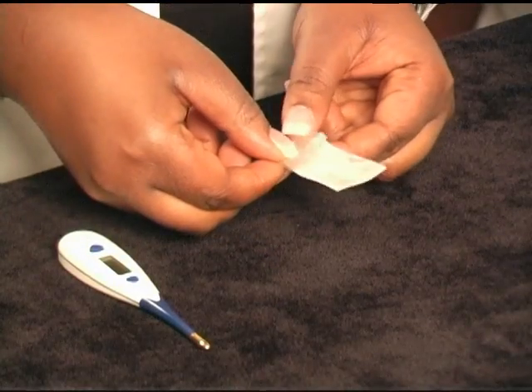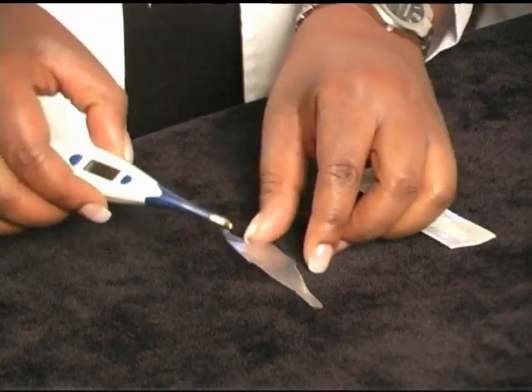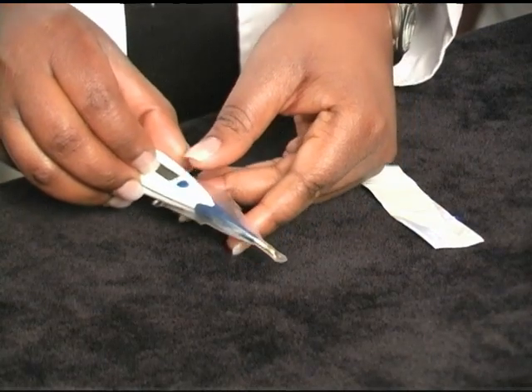If you are using a digital thermometer, first cover the probe end of the thermometer with a disposable cover slip. After taking the temperature, clean your thermometer with soap and water or alcohol as demonstrated before. If you are using a digital thermometer, remove the disposable cover slip and throw it away, then clean the probe using soap and water or alcohol.